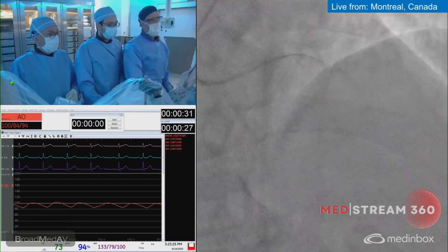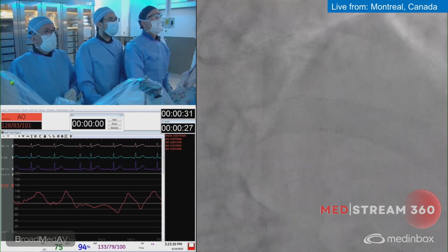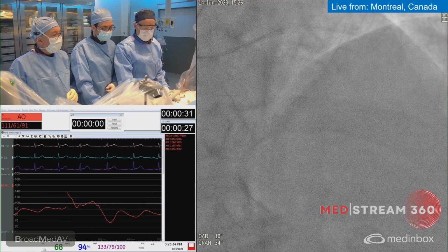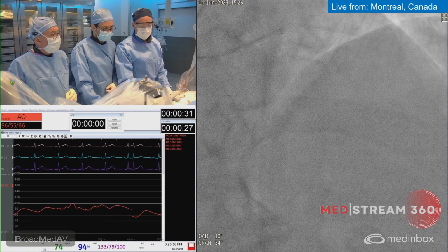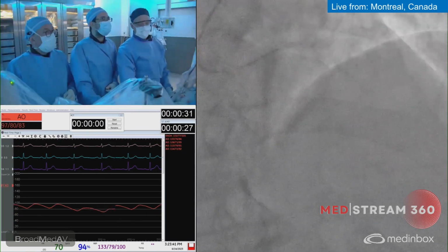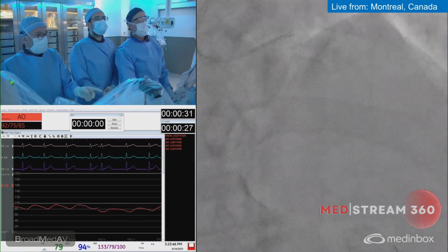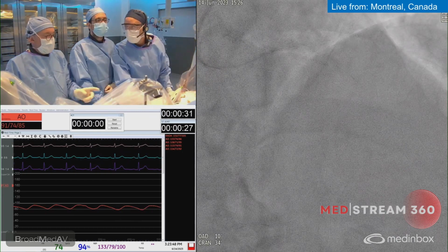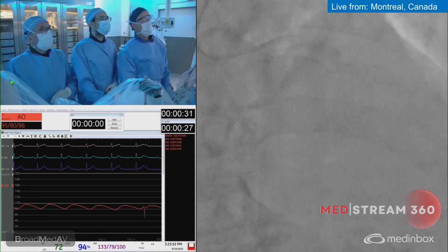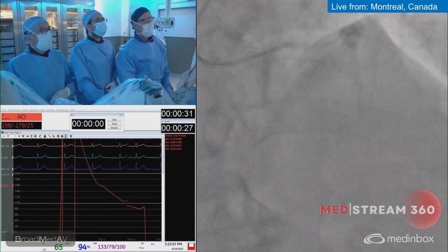Sounds good. So we're going to remove the crown. All right. Can you do a small test? Just a small test, yeah, sure. Yeah. Okay, go. Here we go. It looks good. There's no perforation.